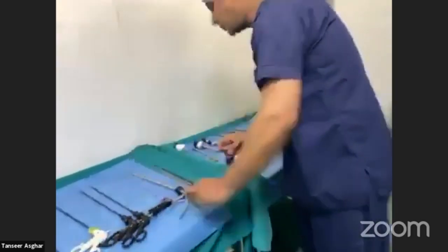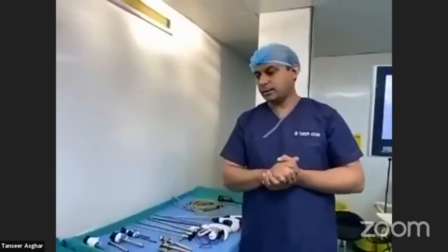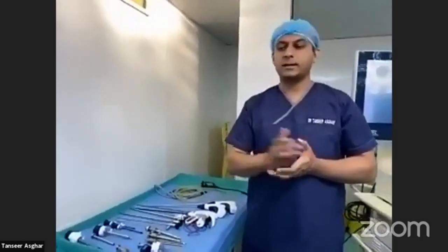That was a brief description about the ports and basic laparoscopic instruments. Basic laparoscopic instruments are usually 35 to 37 cm in length. In bariatrics and obese patients, we use instruments around 43 to 45 cm. The most commonly used are 5 or 10 mm instruments, but in pediatric surgery, 3 mm instruments are also used. Any questions about instruments or graspers are welcome.